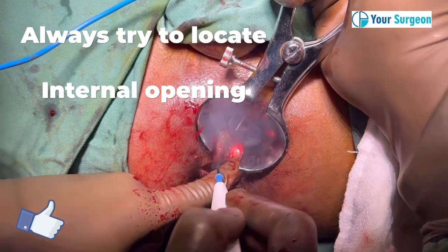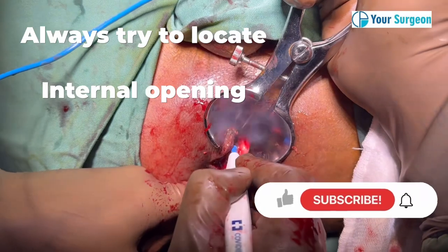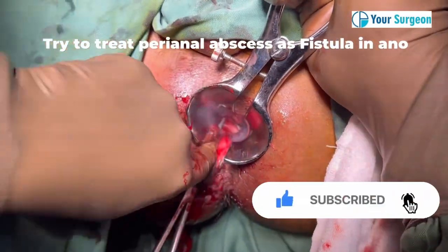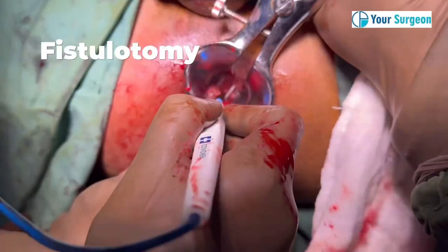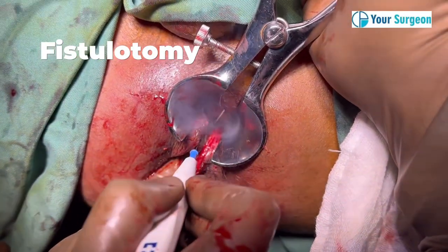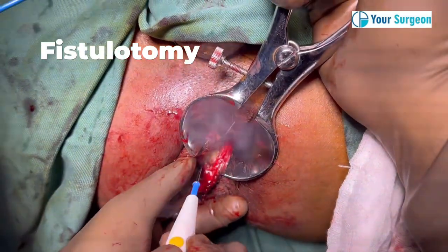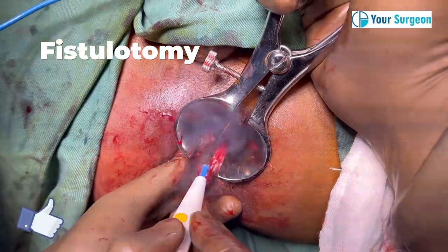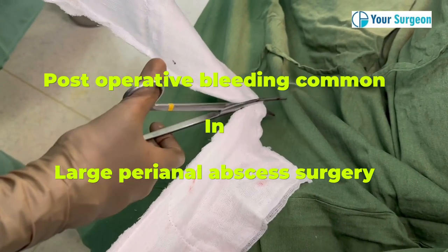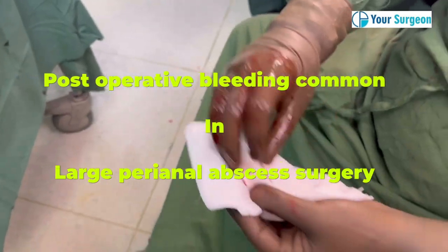For proper hemostasis, we give a thorough wash and then try to look at the internal opening. If you are able to identify the internal opening, the chances of fistula formation can be minimized by laying open the entire abscess cavity or doing a fistulotomy. In this case, we are laying open the entire tract of the abscess cavity and communicating it with the internal opening at the six o'clock position, which is the most common site.